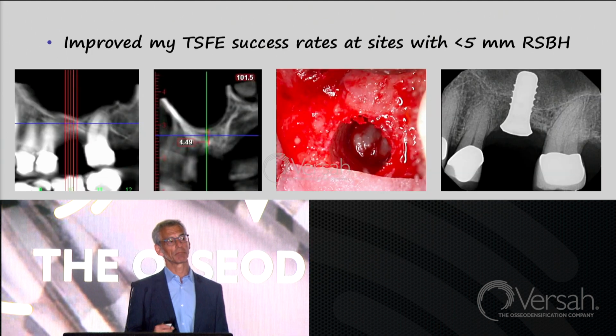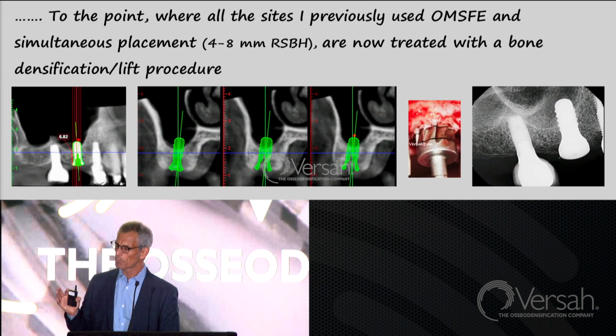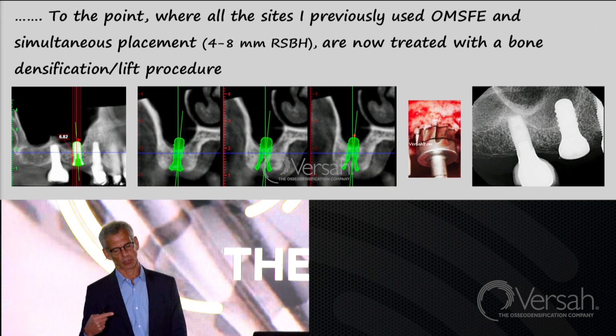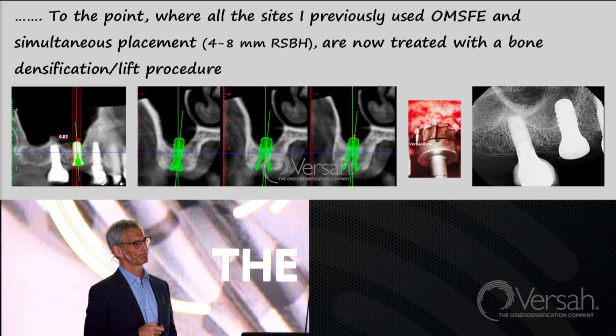And it has improved my success at sites with less than 5 millimeters of subantral bone. To the point where all the sites that I previously used osteotome-mediated sinus floor elevation and simultaneous placement are now treated with a bone densification lift procedure.